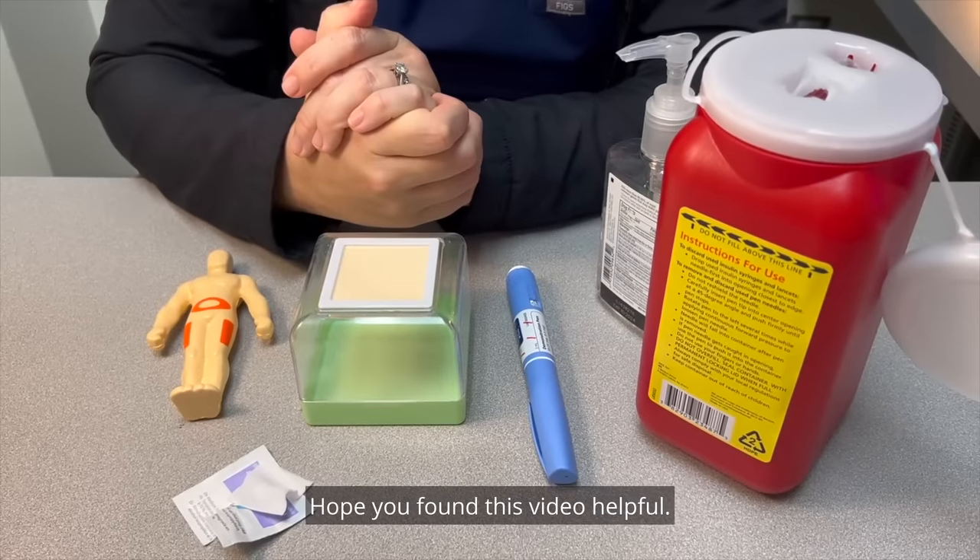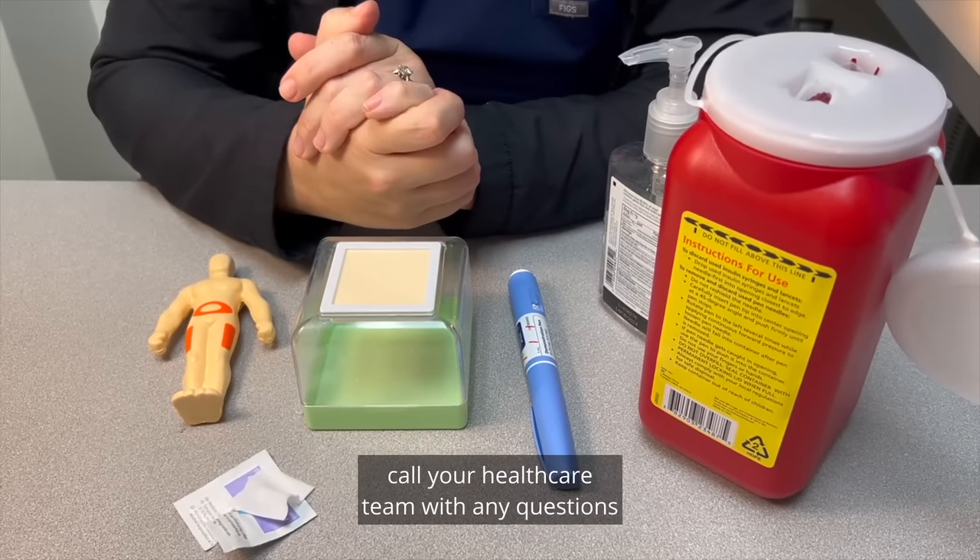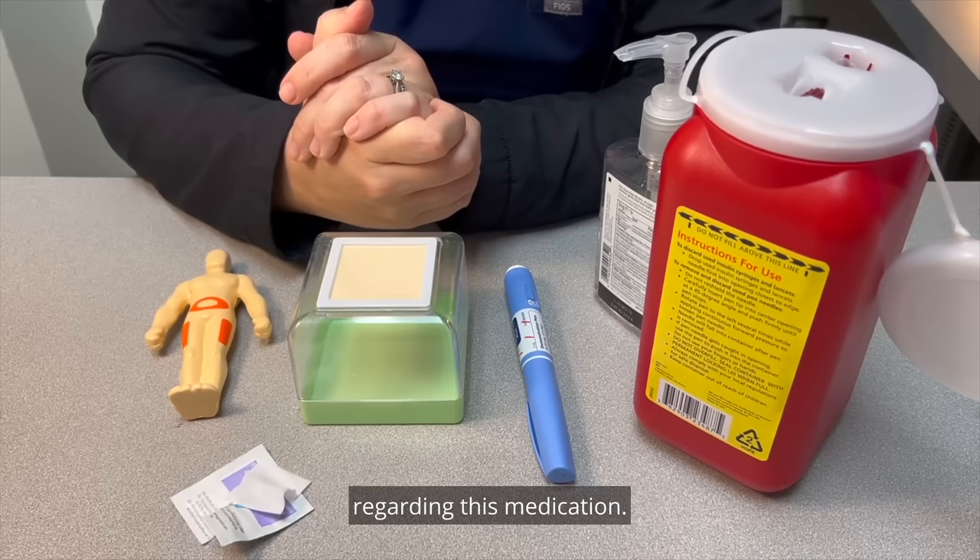Hope you found this video helpful. To reinforce how to use and inject the Ozempic pen, call your healthcare team with any questions regarding this medication.